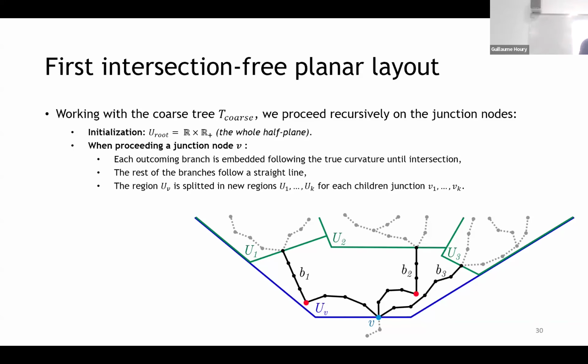Basically, by using a technique where we try to fairly preserve the branchings close to the junction node, we ensure that things are quite well preserved around the branch, that we have rather accurate angles at intersections, and it also gives a distance, or a number of nodes around the junction, in which we are sure to have an embedding that is locally intersection free.